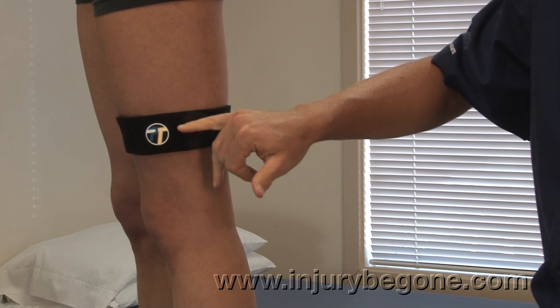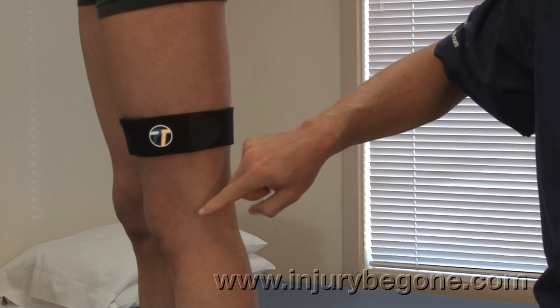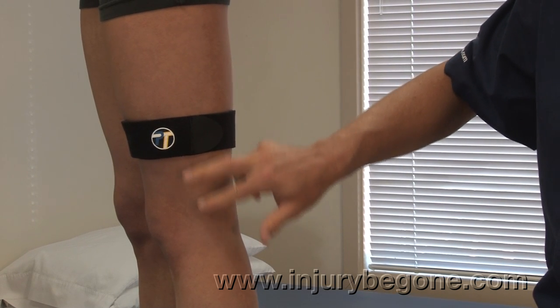This direct compression on the IT Band is going to stabilize it to reduce some of the rubbing and friction in the femoral condyle on the outside of the knee and alleviate pain in this area.